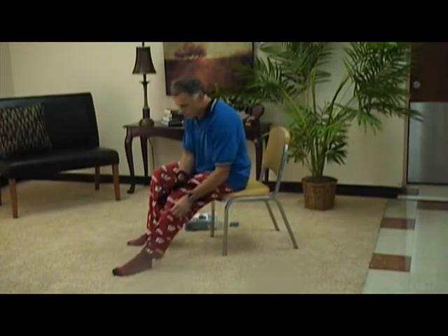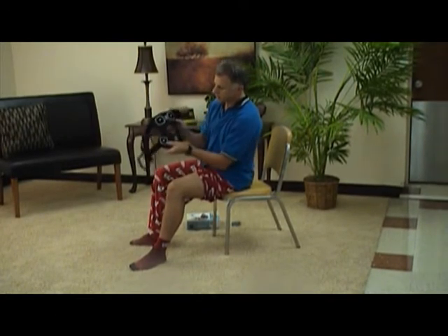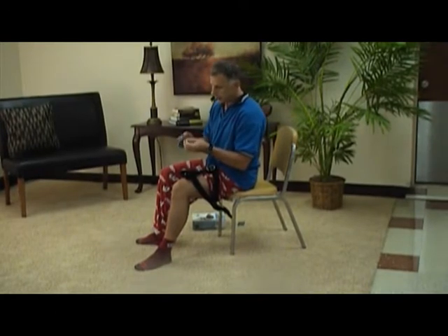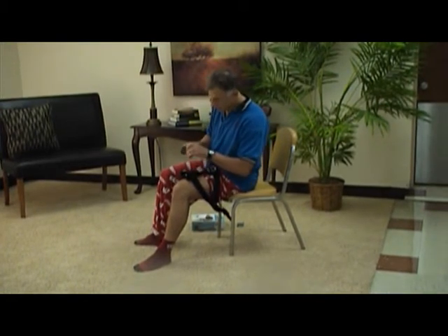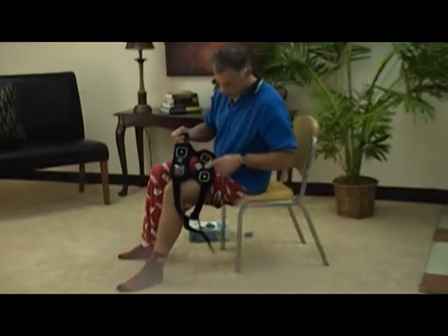All right. With this TENS unit, specifically for the knee, if you're going to have a knee replacement and you can't get in for another month or two, and you're having a lot of pain and not tolerating the pain meds, this is an ideal situation for it. As it comes out of the box, it looks like this. On this side, there are 4 electrode placement pads. You simply take the pads, which come wrapped with special plastic covers to stay clean. Be careful with these, they're a little sticky, but not too bad, and you simply place them right there. They're clearly marked here, here, and here.